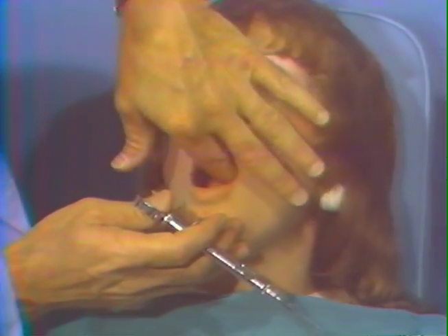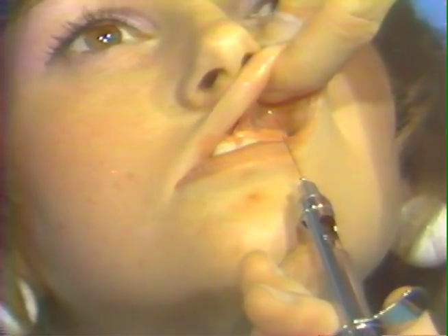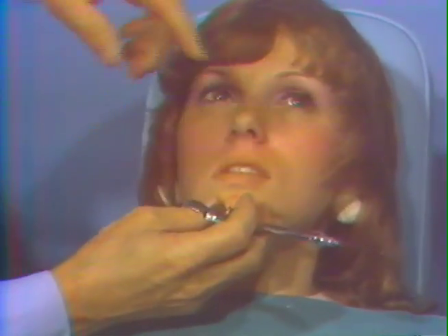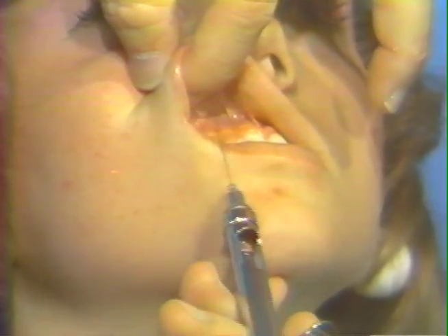open a little bit wider. Let me pull your cheek to the side, don't turn your head. With the finger and thumb, pull the upper lip upward in this manner. The needle is placed for this particular injection opposite the tooth that you desire local analgesia. Pass upward to approximately the height of the apical area of the tooth, then removed. For the right side, turn your head just a little to the left, open a little bit wider, pull the upper lip up in the same manner with the finger and thumb, the same direction, axial direction, upward, in line with the tooth that you care to anesthetize for the anterior superior alveolar nerve.